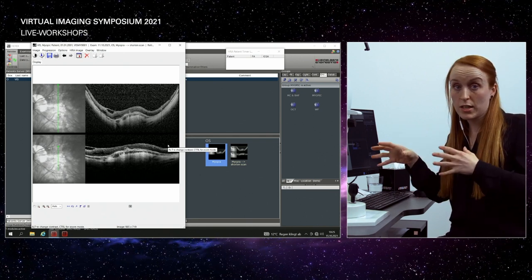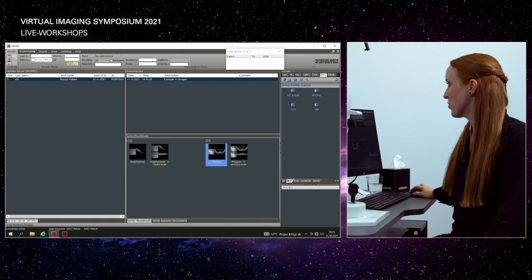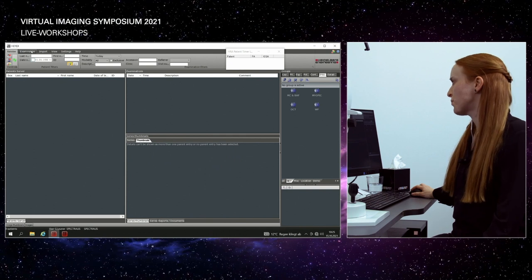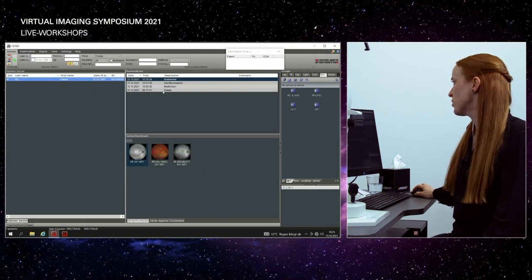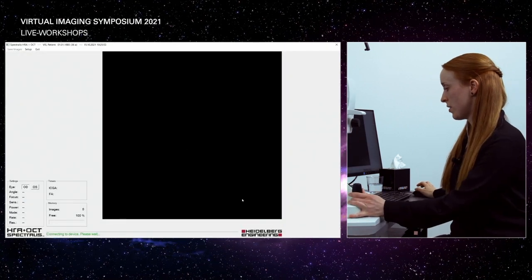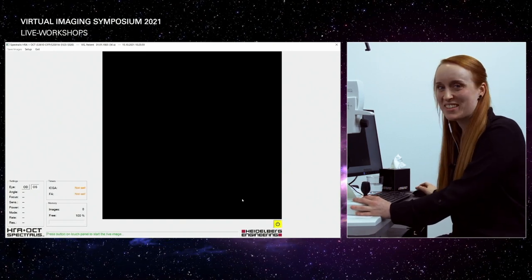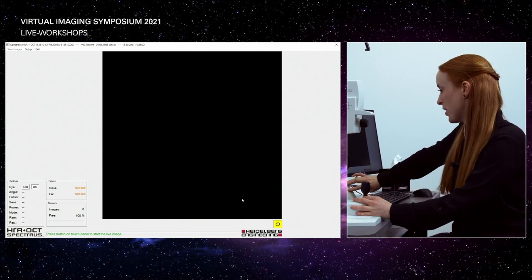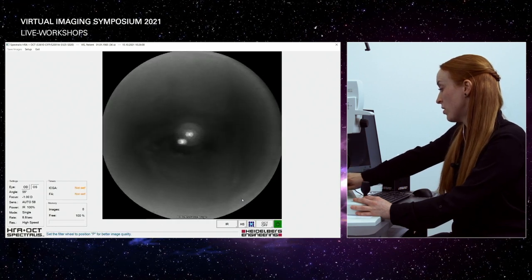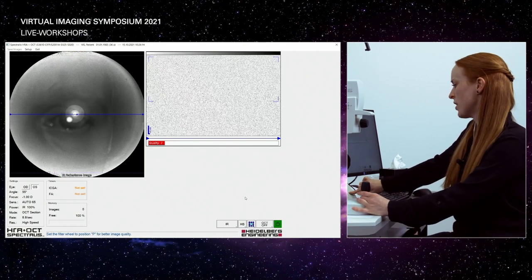And how to do that, I'd just like to show you in the acquisition module where to find those important buttons, okay? So I'd like to have a new examination. I'd like to have the retina acquisition continued. Okay, so again, my patient is just healthy. And therefore, I just brought you those pictures so that you can imagine what it is good for. And I will now show you where to find it, okay? Just a second.